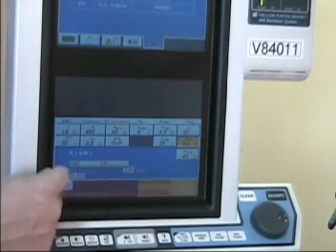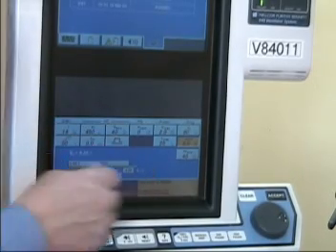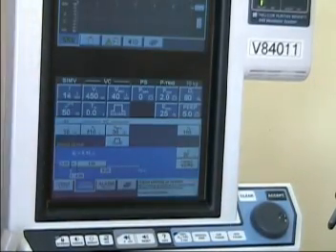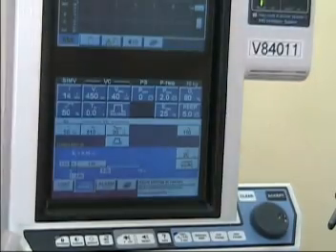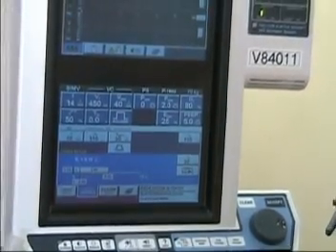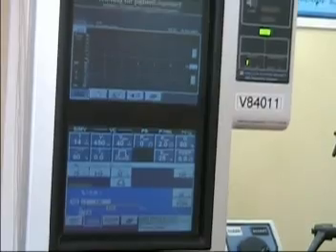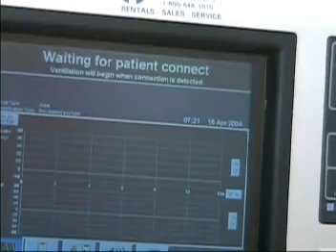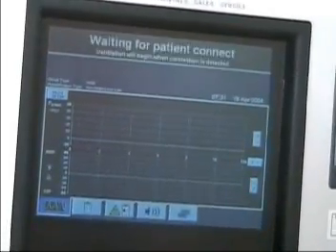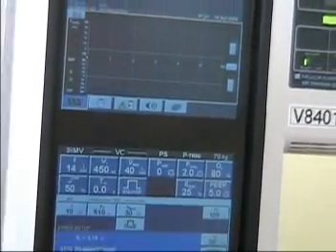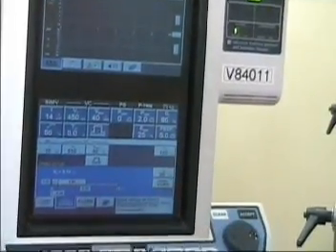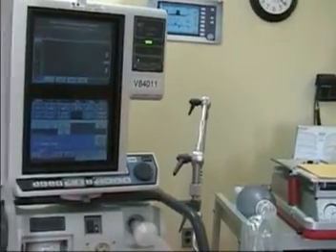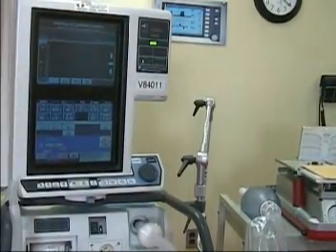Now we have all the settings. We can adjust a few other things, but then we press accept. The ventilator is now in a mode ready for patient use and is giving us a 'waiting for patient connection' message. Note — nothing is happening. The ventilator is not ventilating; it's just in standby mode. This is ideal for when you have a patient coming back from surgery.